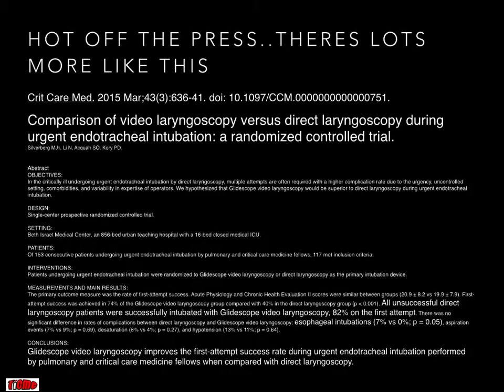It's not just me, there's a lot of evidence out there showing that video laryngoscopy is better than direct laryngoscopy in most situations. This is the most recent article I could find from Crit Care Medicine only a month or two ago, and it showed that all of the unsuccessful direct attempts were intubated with the Glidescope, and 82% of those on the first attempt. There were 0 esophageal intubations with the Glidescope, but 7% with the direct laryngoscopy technique. There are lots more showing very similar numbers.